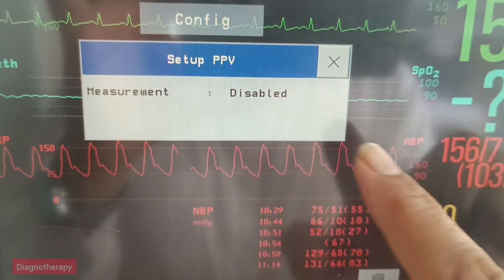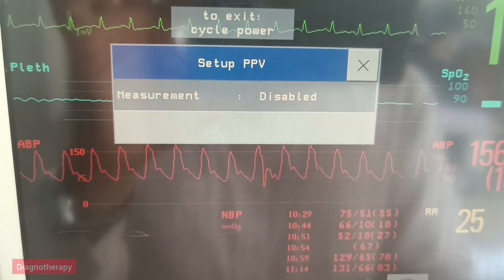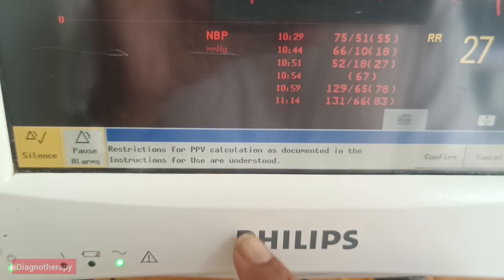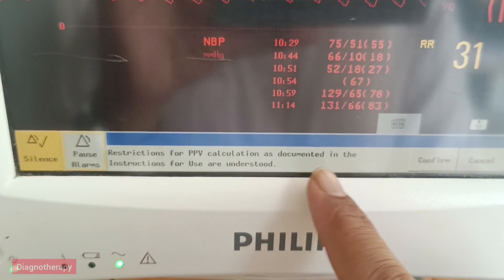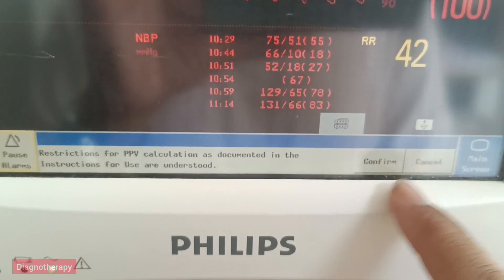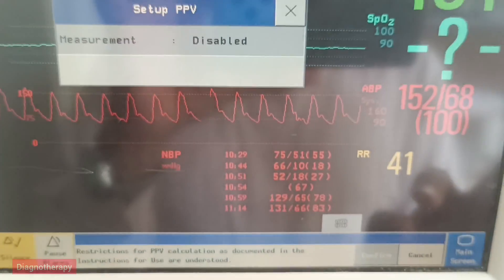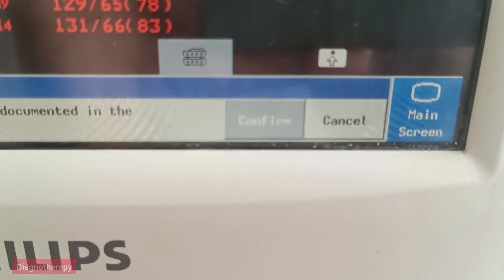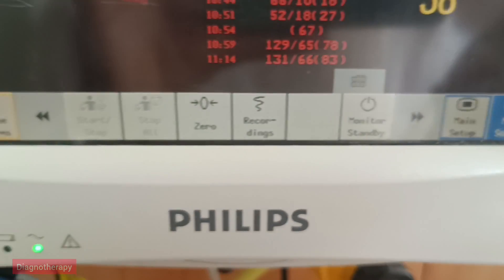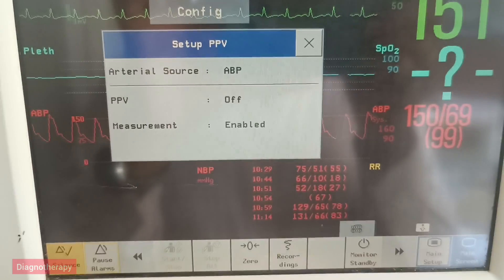Enter into that and it will show as disabled. For enabling, select it and roll the knob. It will show one message for confirmation. After confirmation, it will get enabled — this is now called enabled.